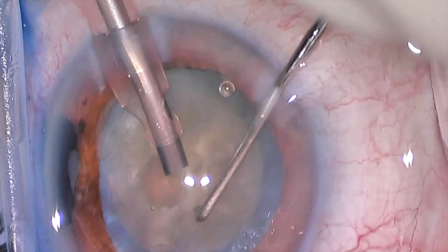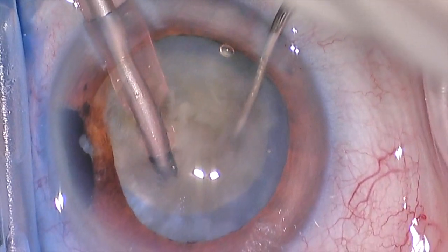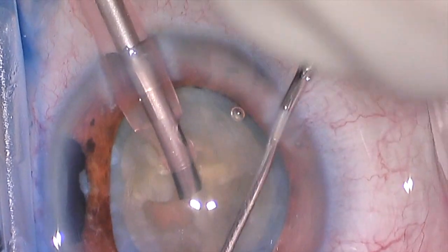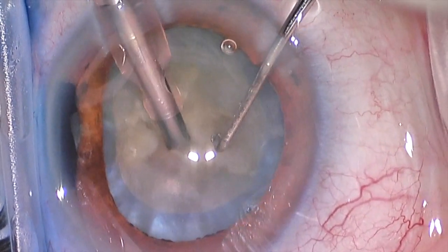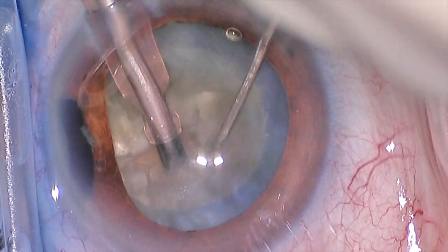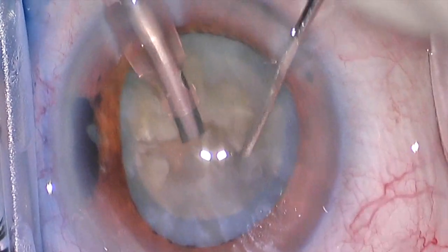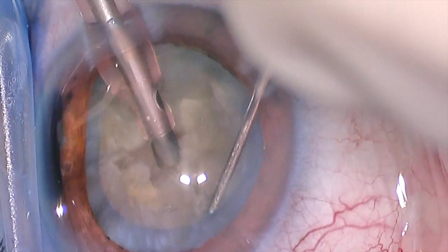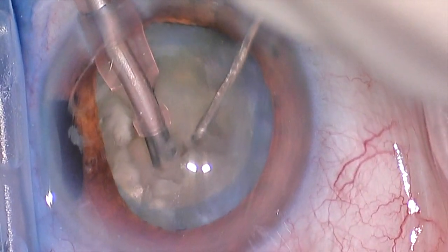This particular cataract is in an older patient, so it's a very dense, very thick lens — not soft at all. The technique here requires some patience. What we do is take our instrument and go out over the edge of the lens and gradually chop the lens into multiple pieces. When I say chop, I mean we bring those two instruments together — spreading them apart and then bringing them together, pulling the second instrument through the lens to break it apart.